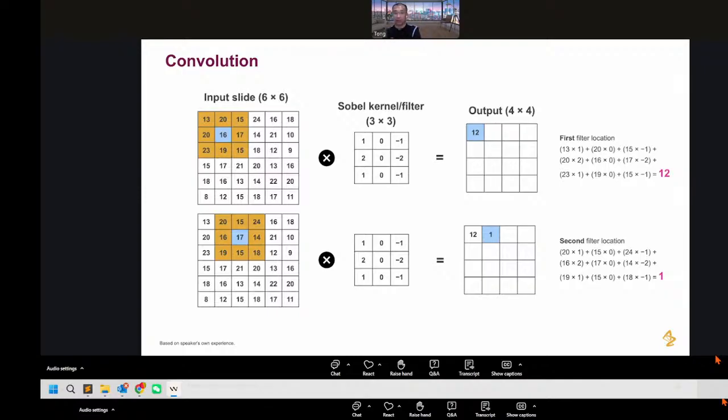So why are we doing this? It's trying to simplify the high resolution image, to get a smaller feature set that still represents the data. If you have too much data, you need very powerful computing resources to calculate it, which is too expensive and we can't afford it.